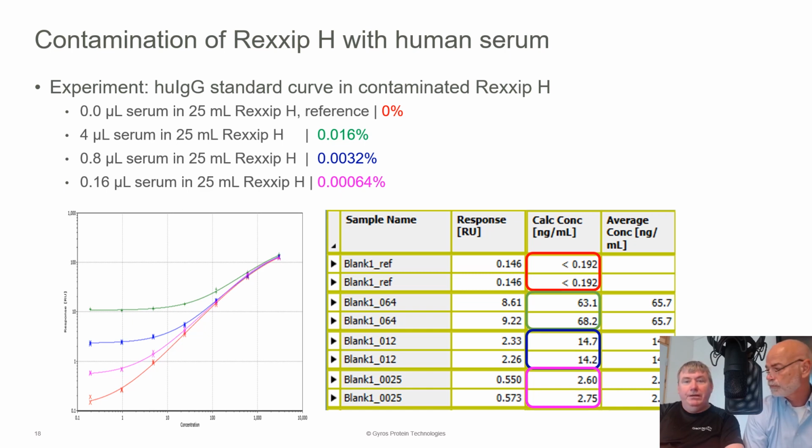Yeah, I mean, I think very early in my career, we used to run a lot of radio immunoassays, and there was always a potential for contamination, particularly when people were preparing the test articles or the matrix. So it's always best to handle those things away from the area where you're doing your assay to prevent contamination. And then aliquoting is a standard good practice to make sure that you're not going to go back into the bottle with a contaminated tip. No, exactly.